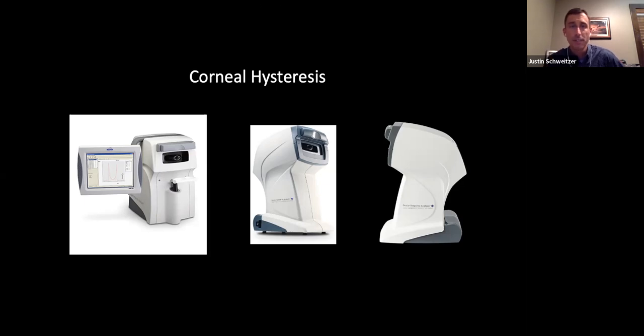Great question. Does the CATS tonometer give the same pattern as Goldman? It does. And so initially it looks exactly the same way. It's a little tricky the first couple times you do it because it's very sensitive, but once you do it a few times, the pattern's exactly the same and you become very proficient at it. So no learning curve with it, except initially getting it on the eye correctly is just a whisper trickier at first because it's a new device. But the pattern looks exactly the same. So thanks for that question.